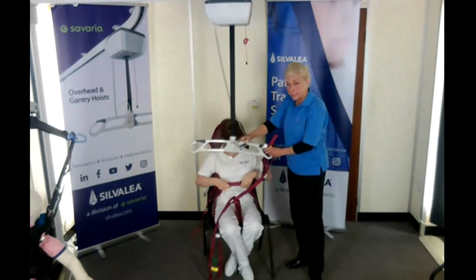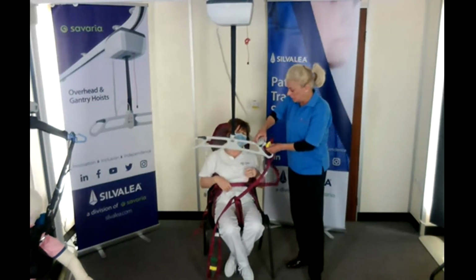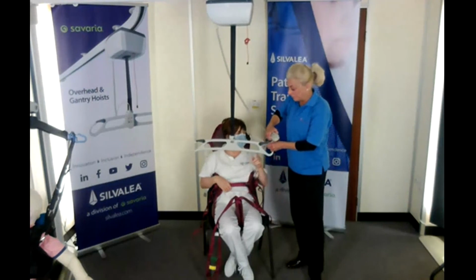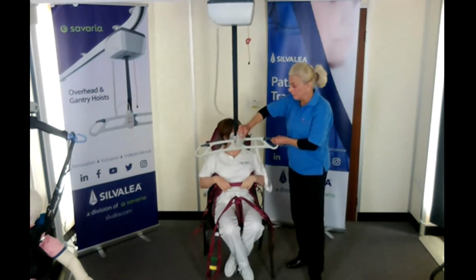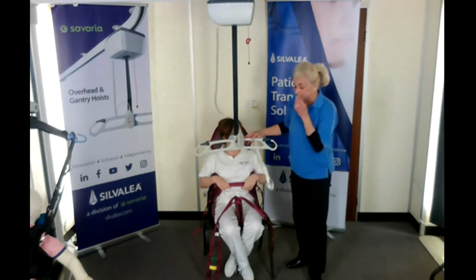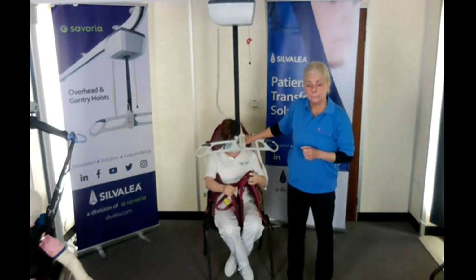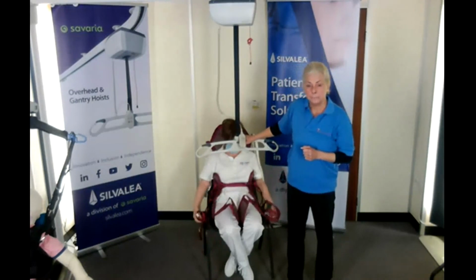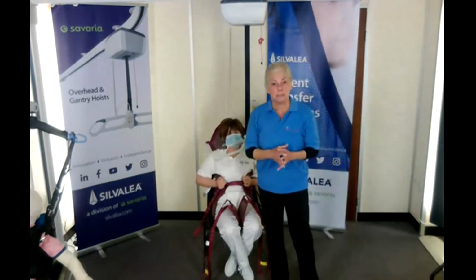I did see a couple of questions there, Alice. I don't know whether I've answered them or not. I've just answered a couple, but we've got one question saying, do they need sitting balance for this? I explained that this is for poor and reduced tone. They've also said, is there a risk of falling through? Not if it's fitted properly. So you need to make sure that the fitting is correct.